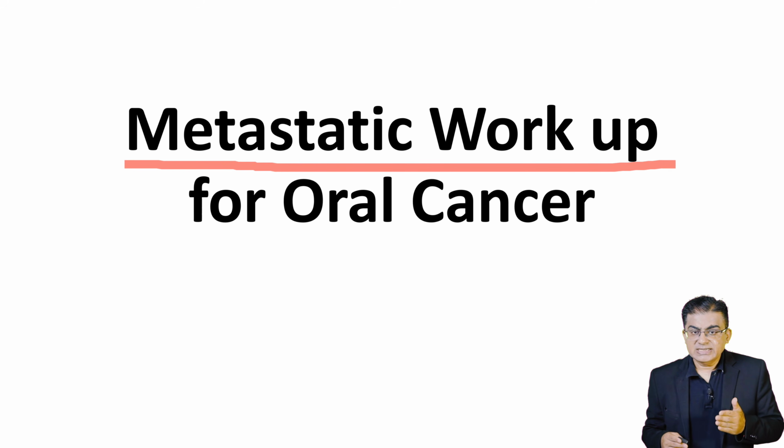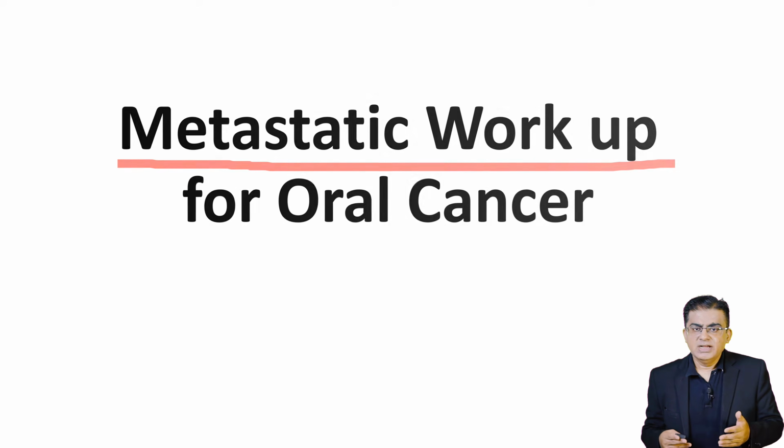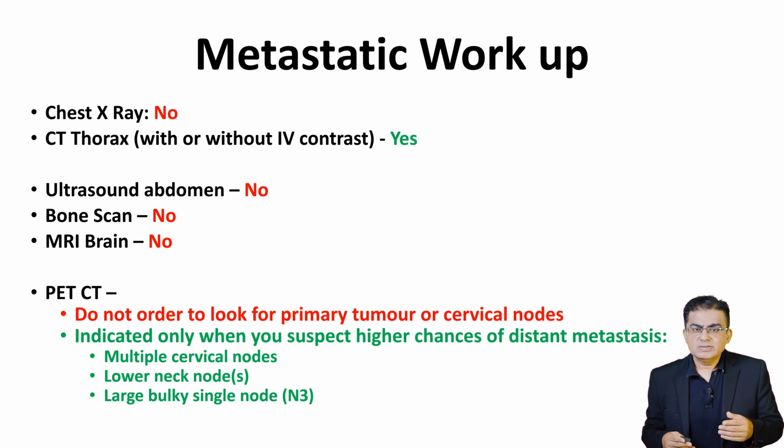Should you order a standard chest X-ray? No. A plain radiograph chest X-ray may pick up large lung masses but completely misses small or subpleural lesions. You must order a CT of the thorax with or without IV contrast. That is up to you. I do it without IV contrast in my practice. So CT thorax is your mandatory investigation for metastatic workup.